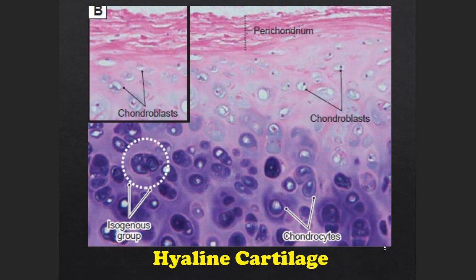Constituents of the bone will mainly be your inorganic and then your organic component of the bone, and the remaining part is your water. This is all done. Then come your cells. You will have osteoblast cells, which are the lining cells of the bone. Then you will have your osteocytes that are embedded inside the bone or inside the trabeculae of the bone, surrounded by lacunae. Then you will have multinucleated giant osteoclasts that cause your bone resorption.